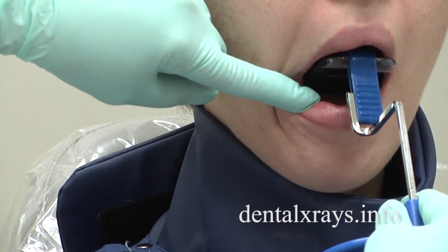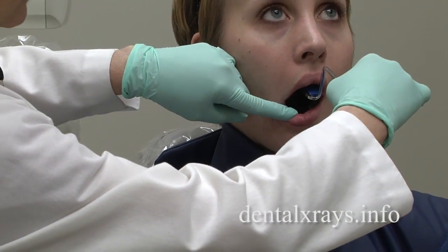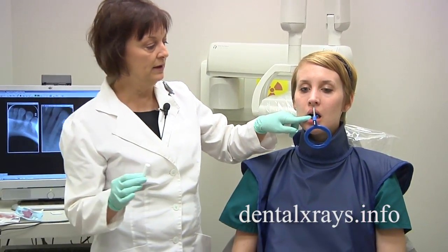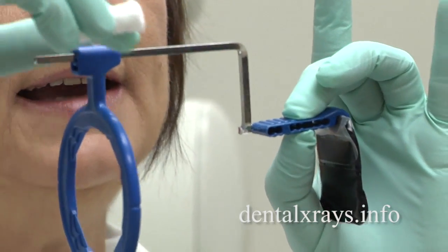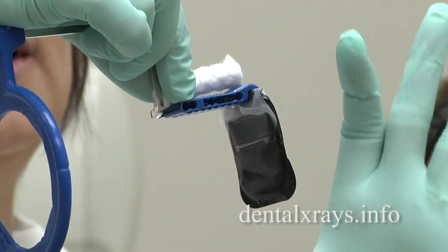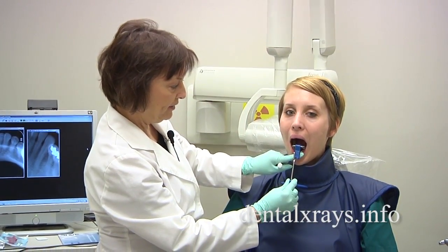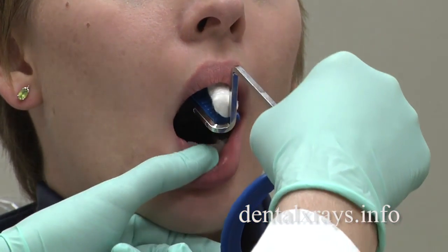Before she closes, I'm going to roll the whole unit upward and then have her gently close and bite. Your goal is to get the lower teeth right up onto the bite block. What helps sometimes is if you use a cotton roll. She really has to close to reach this bite block, and to make it easier on the patient, if you put a cotton roll on the upper part of the bite block, she'll be able to secure the whole unit in her mouth more easily. So I'm going to put it way back there, roll it up, and then place the cotton roll right under the front teeth and have her close and bite.